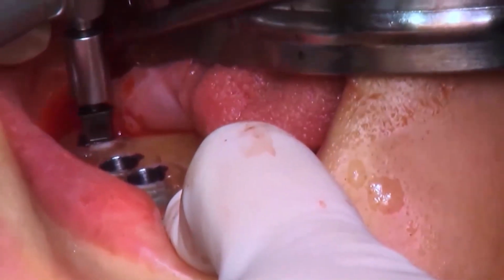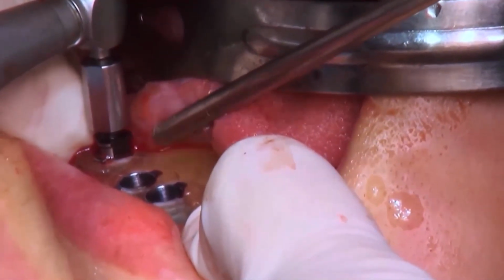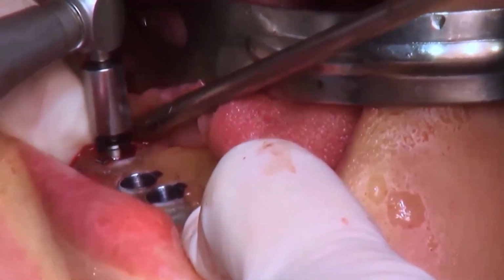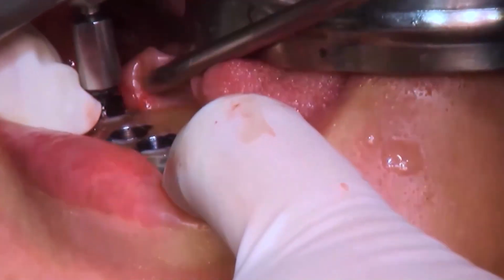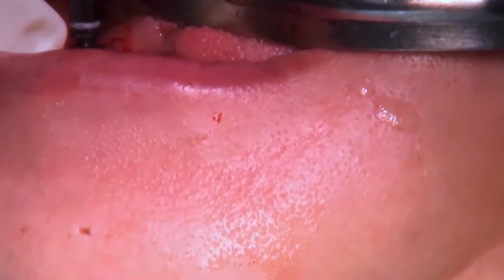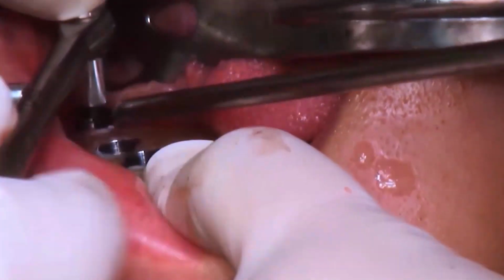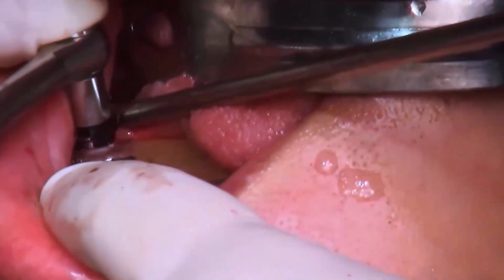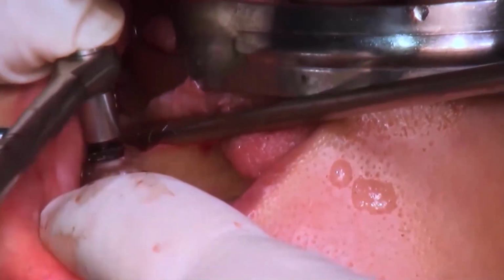The third implant, in the molar area, I got a severe torque. You see here, placing the implant with a ratchet.